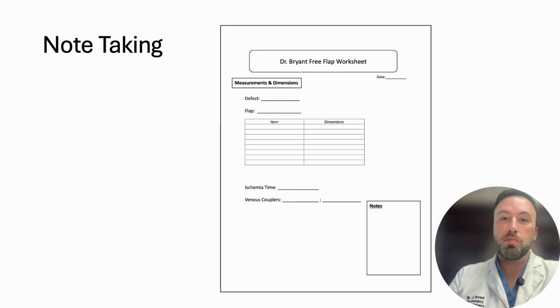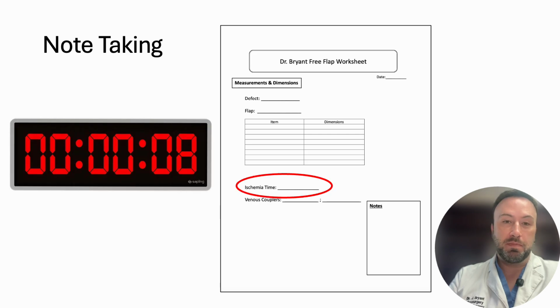During the case, you may be asked to note and record dimensions and times, such as free flap ischemia time. This helps in maintaining an accurate record and in improving efficiency in the future.